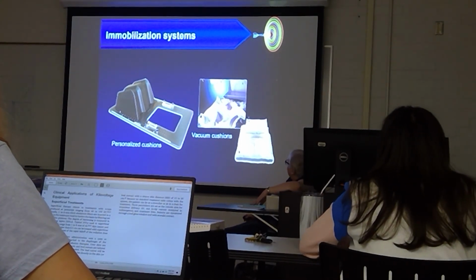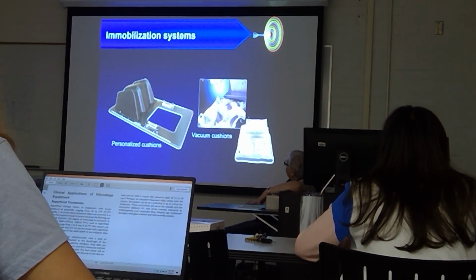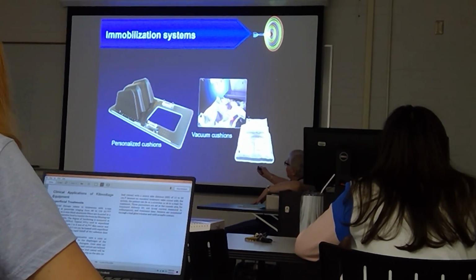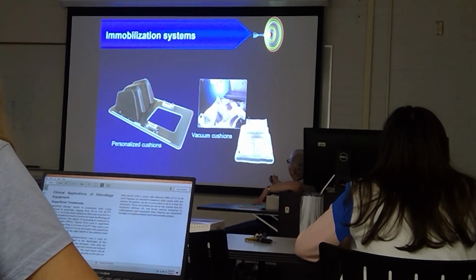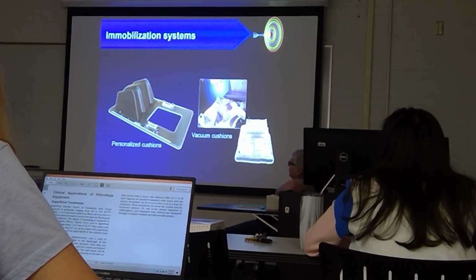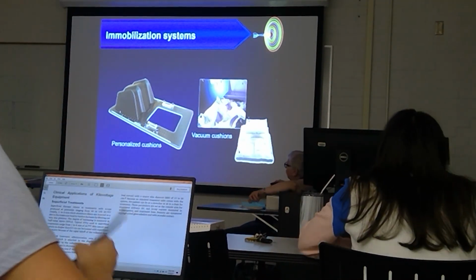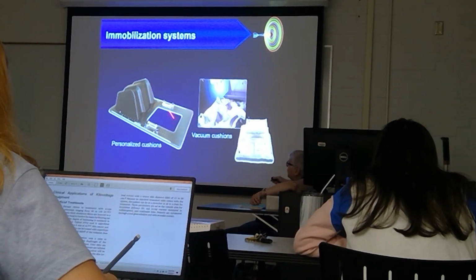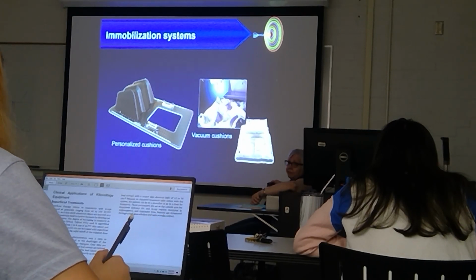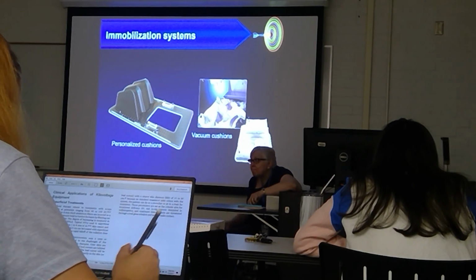The immobilization systems, do any of these look familiar? This is a mat. So is this, a weird one, I must admit. Has anyone seen anything like this? No. It's a new system. They actually attach to the bed. This is for the patient's knees. Of course, you wouldn't use these when you treat the prostate, right?